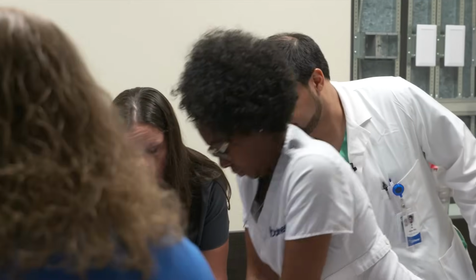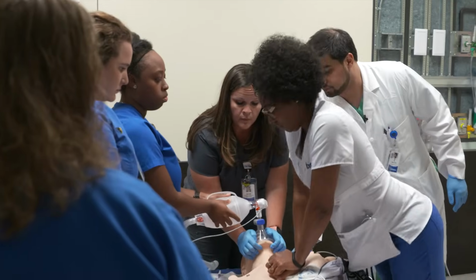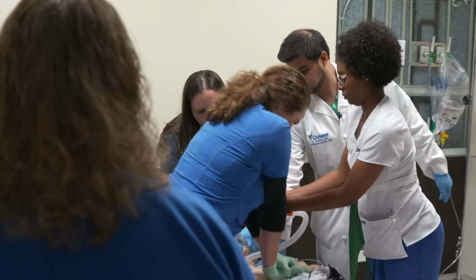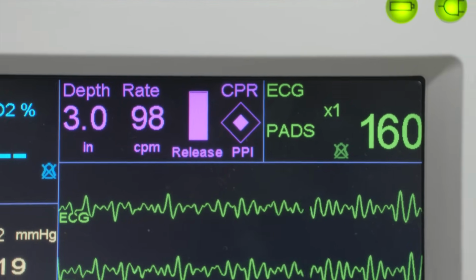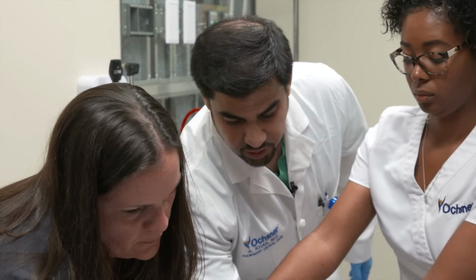Good compressions. 1 milligram of epi in. Good. Looks like we have a good airway and you're ventilating. At pulse check, we're going to switch compressors. Looks like it's VFib. Let's go ahead and shock. Charging at 200 joules. Everybody staying clear. Shocking. Shock delivered. Resume CPR. Resume compressions. It's 10 seconds till pulse check. Pulse check. He has a pulse with compressions. Hold compressions. We have a pulse. Good job, guys. Let's secure the airway and let's call the ICU.